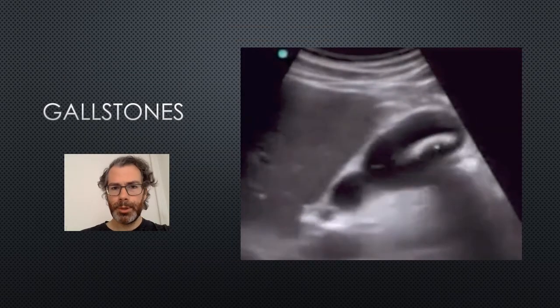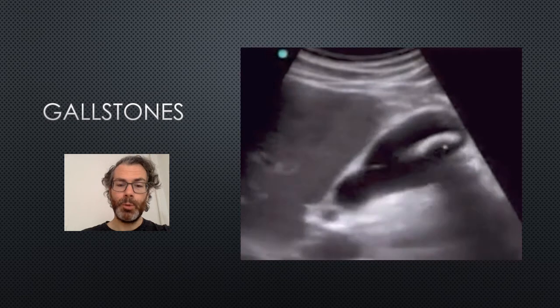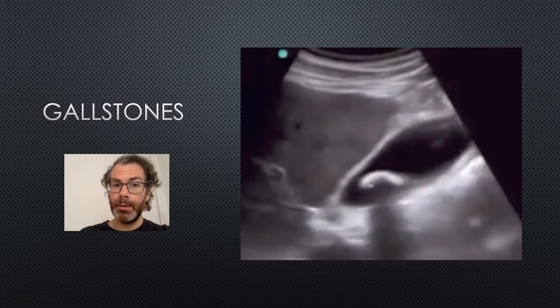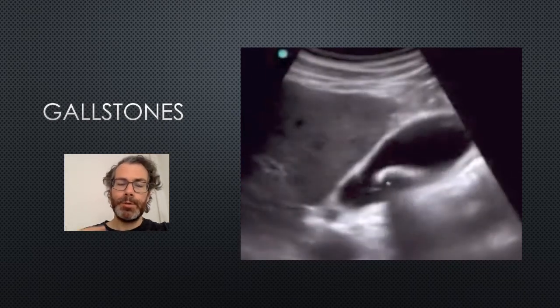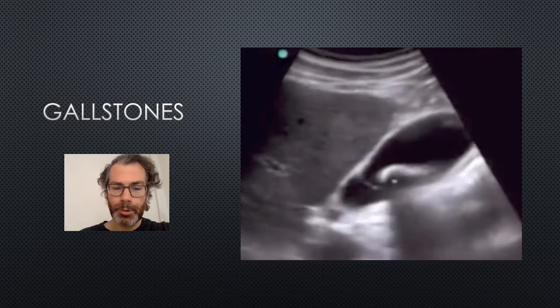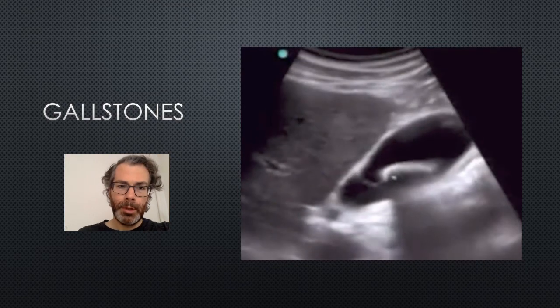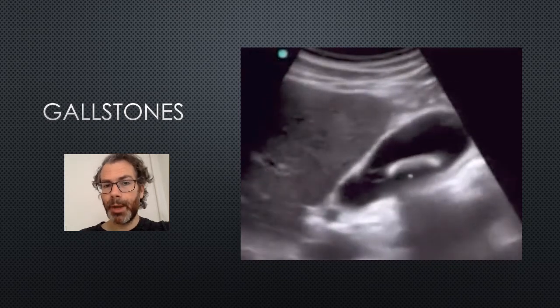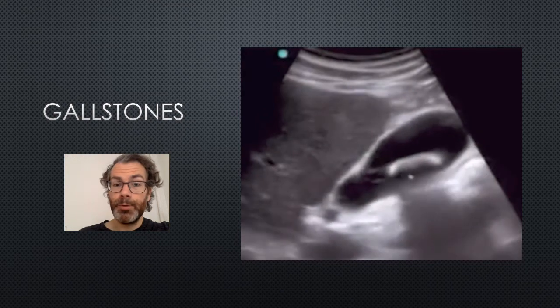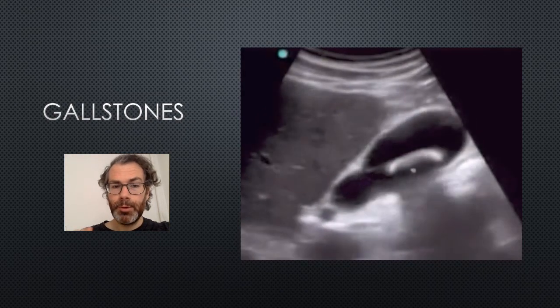Okay, so say you see a gallstone in the neck of the gallbladder and you wonder, could this be causing the patient's pain? One useful test you can do is to assess whether that gallstone is mobile or impacted. If it's mobile, it's probably not causing a problem. It's only when the gallstone becomes impacted or stuck in the neck that it actually causes a problem. By rolling the patient onto their side and scanning them while you're rolling them, you can pick up the gallstone rolling back into the fundus, sometimes referred to as the rolling stone sign. So if your gallstone is mobile, it's probably just incidental.